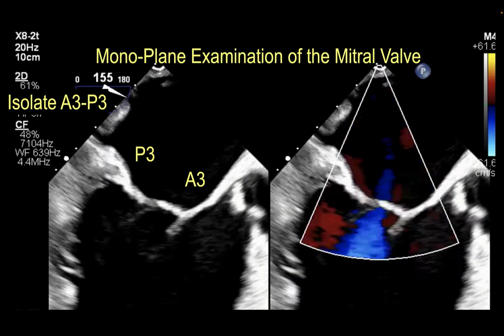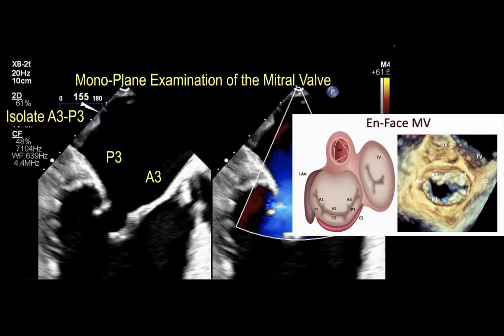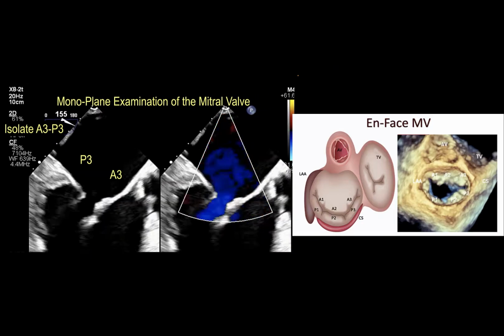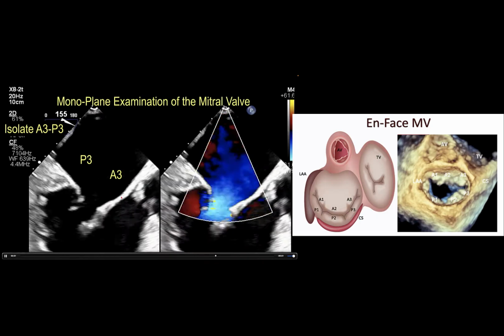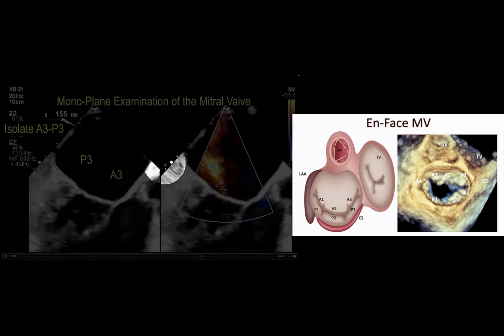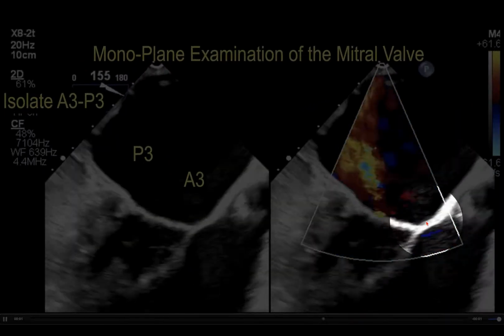And it's very obvious in this situation that there is only one regurgitation jet and there's nothing coming out of the base of the anterior leaflet. But that's not the whole story. If it's something which is outside the zone of the imaging plane, and if you're moving too fast, it is possible to miss it, and that's why perforations are sometimes missed. So that was my first thing to solve this.